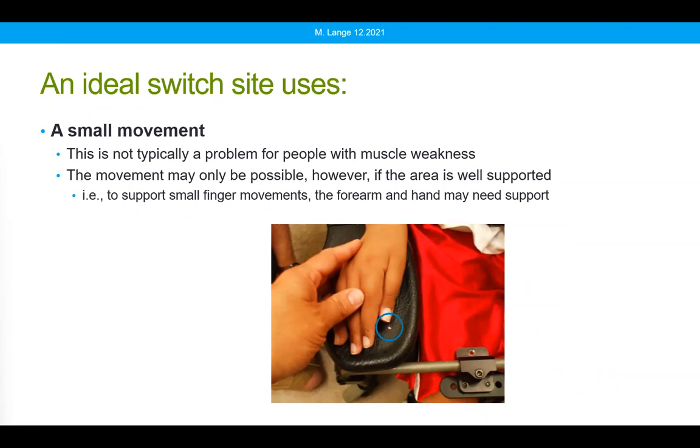We do have a question here. Laura has asked for a power wheelchair. Can you use something like a switch latch and timer so the user does not have to use sustained force? We wouldn't use a switch latch and timer with a power wheelchair, but on power wheelchair programming, there is a feature called latch, and usually we latch forward, occasionally reverse. So the client activates a switch, the chair is going to keep moving forward until it receives another command, which is typically reverse, and that stops the movement of the chair.